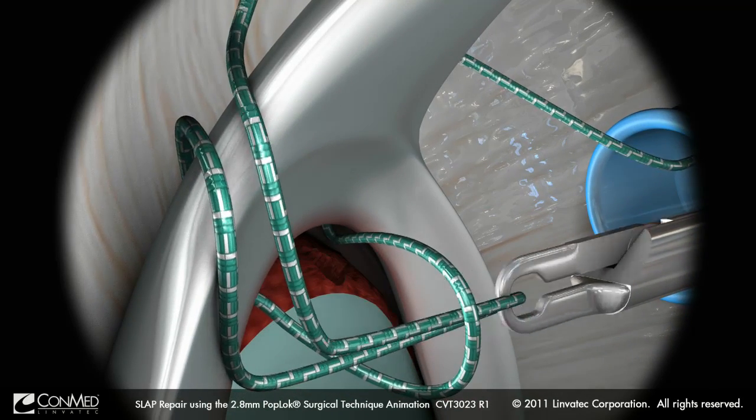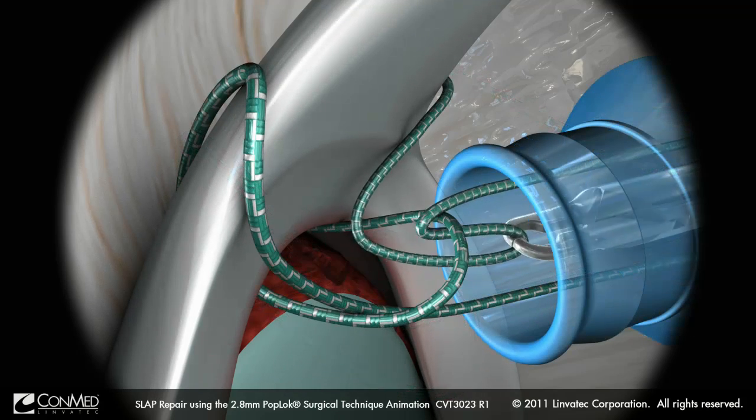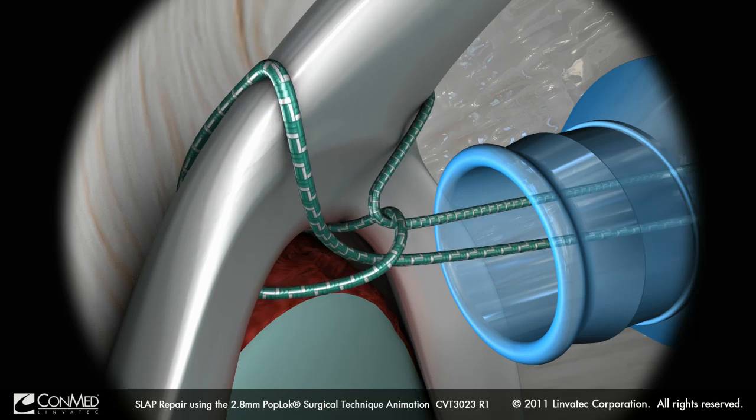A looped grasper is used to retrieve both ends of the Hi-Fi suture through the suture loop, and the loop is tightened.